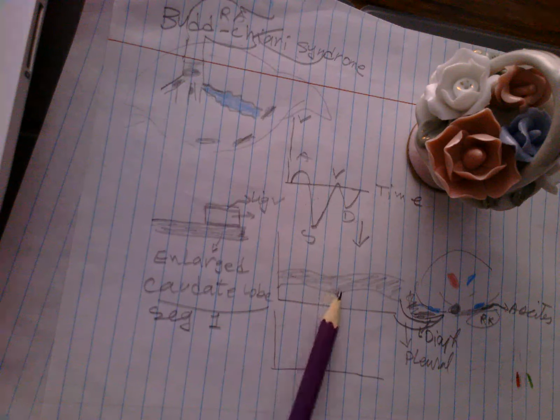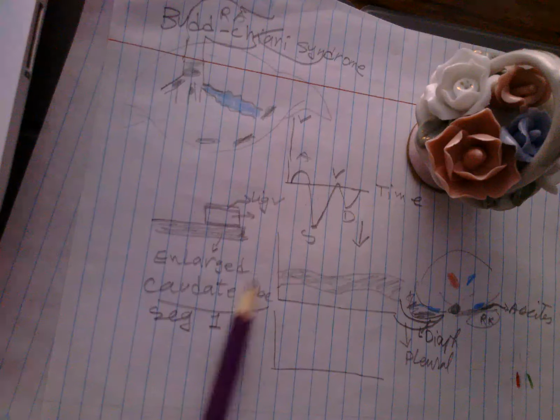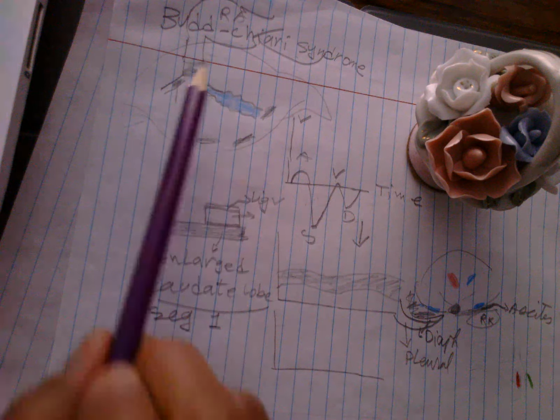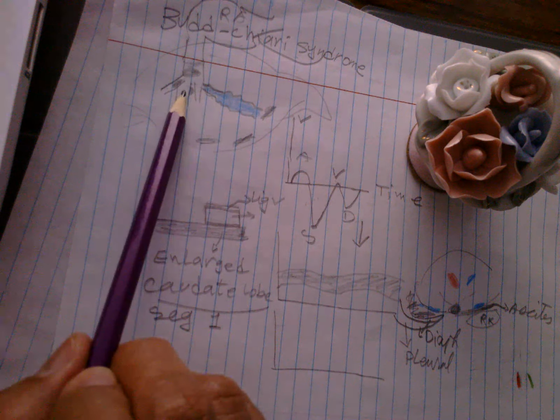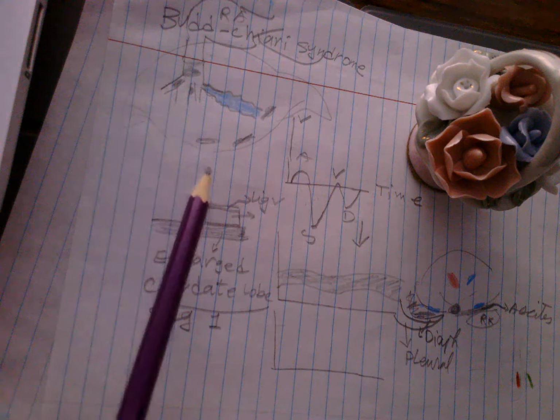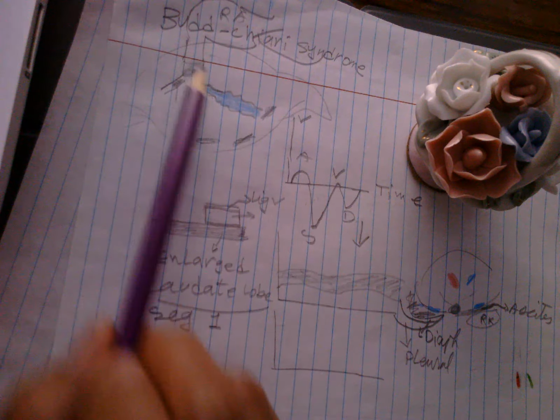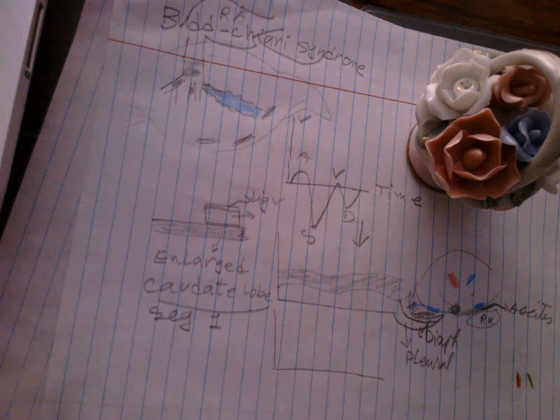So all these points are very important. If you have an enlarged caudate lobe, search for the hepatic veins. Are they normal with color, hepatofugal, all three, and the IVC and spectral?